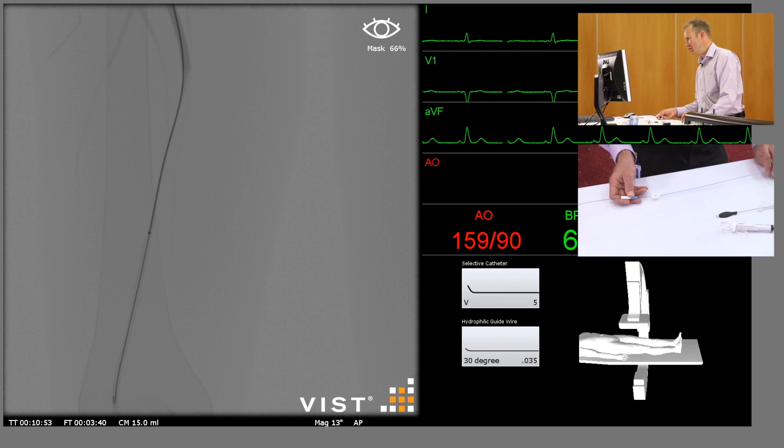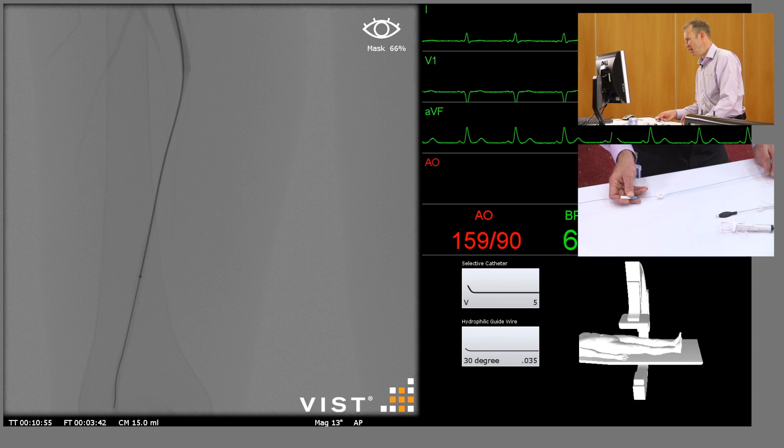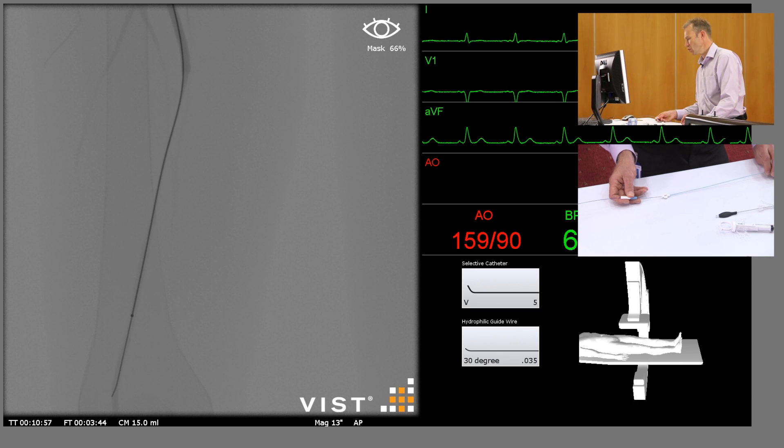I'm now going to take the catheter down through the end of the stenosis towards the end of the guide wire.